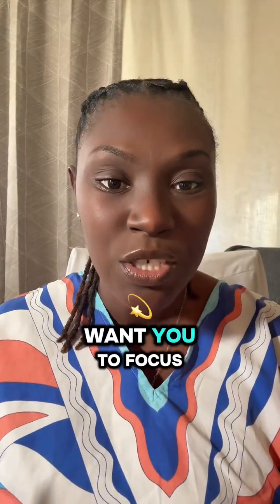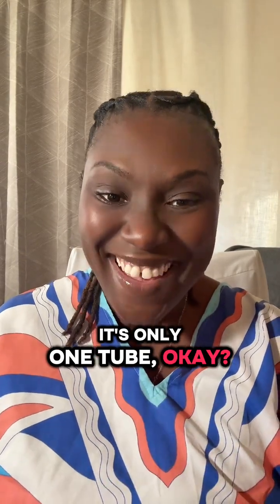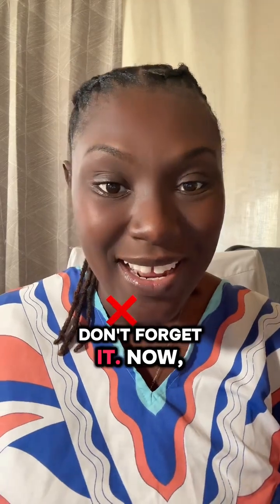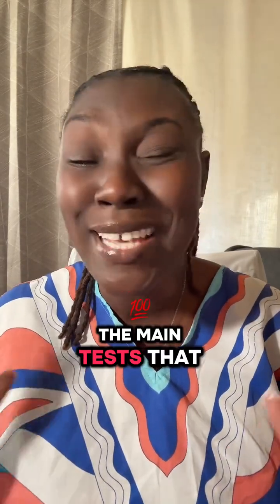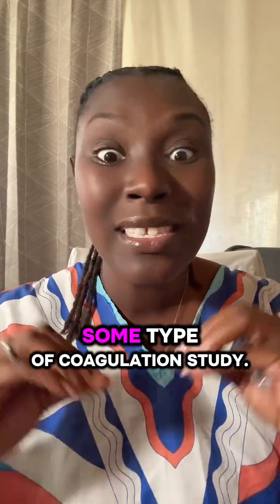The next category I want you to focus on is coagulation studies. It's only one tube, okay? And that is your light blue tube. Remember, there's a ratio of 9:1, blood to additives, QNS. Don't forget it. Now, the main tests that will always go along with any light blue tube will be your PT, PT/INR, PTT, APTT, and your D-dimers. All of these tests have to do with some type of coagulation study.